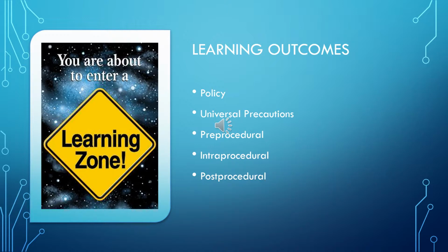Second, we need to make sure we are also following universal precautions. We need to protect ourselves as well as our patient. So make sure when you're doing this type of testing that you follow such precautions.